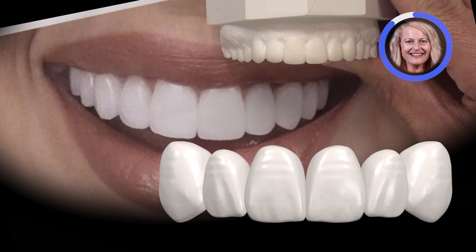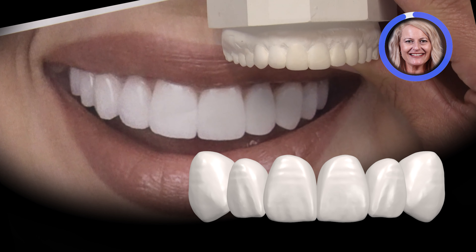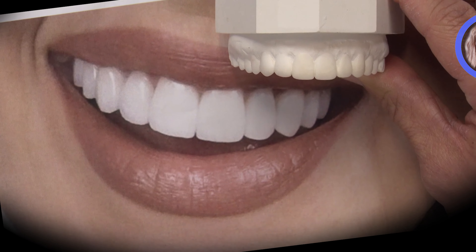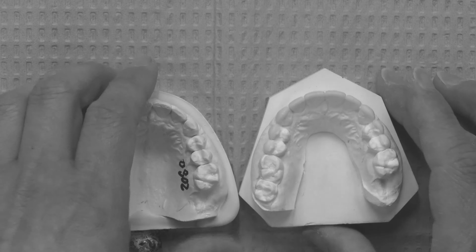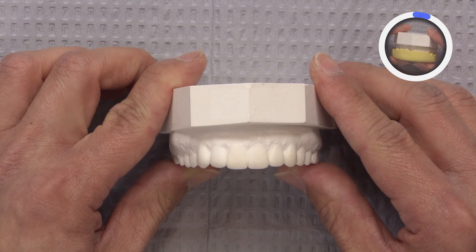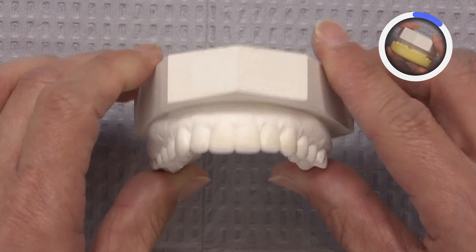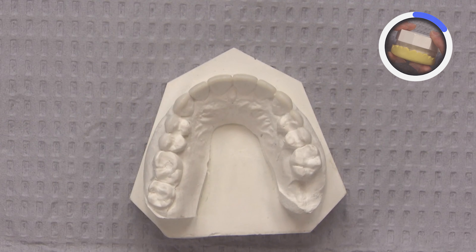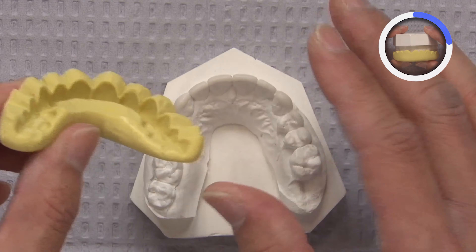It's certainly longer at the centrals, which we consider aesthetically pleasing, with slightly shorter laterals and canines that have some prominence to them. From the wax-up, it's important for us to be able to transition this, or at least have the patient preview what this smile is going to look like. So in order to do that, we create a putty matrix that is shaped to the wax-up.